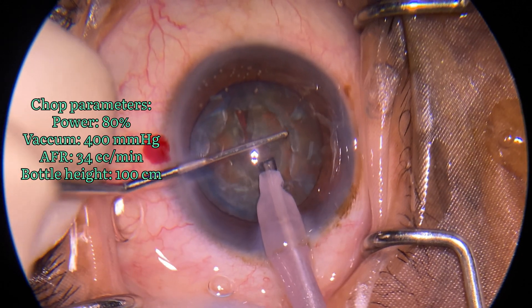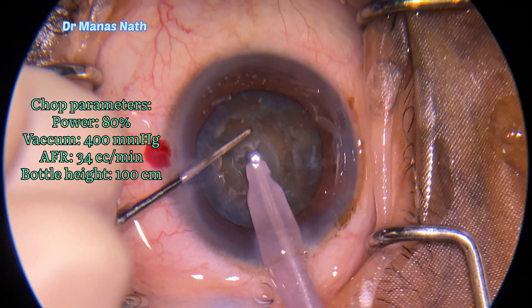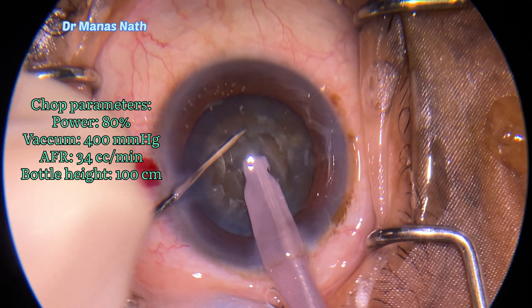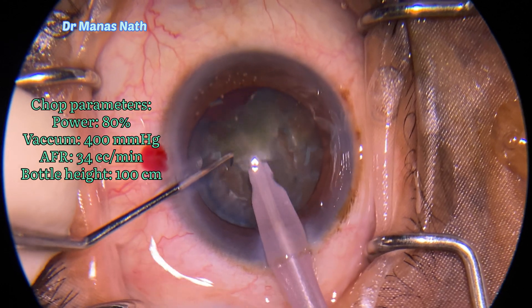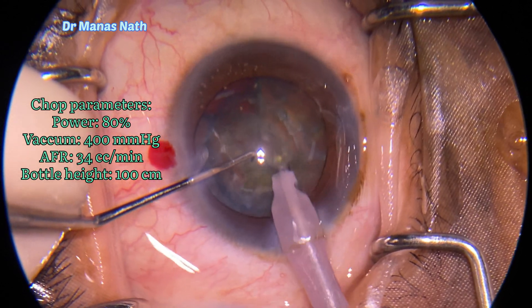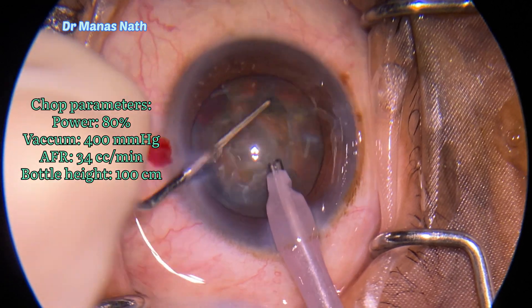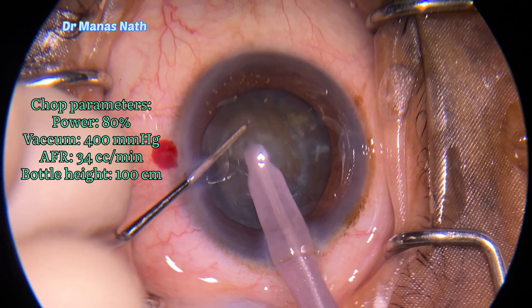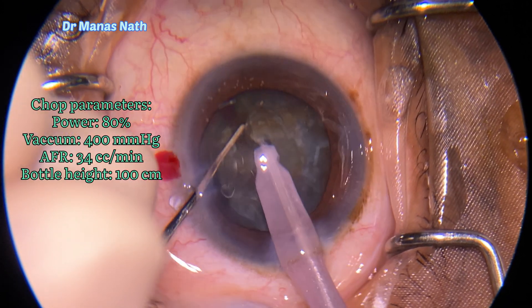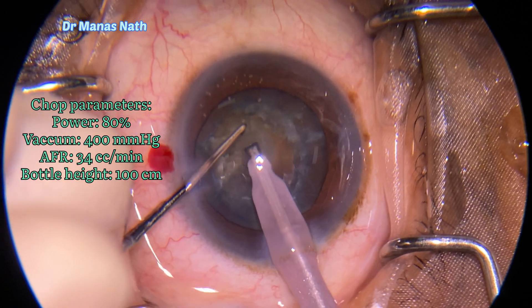My plan is to do the chop into around six to eight pieces, taking out one pie at a time so as to debulk the bag. Doing the chopping with a sharp chopper, with parameters as mentioned on screen.